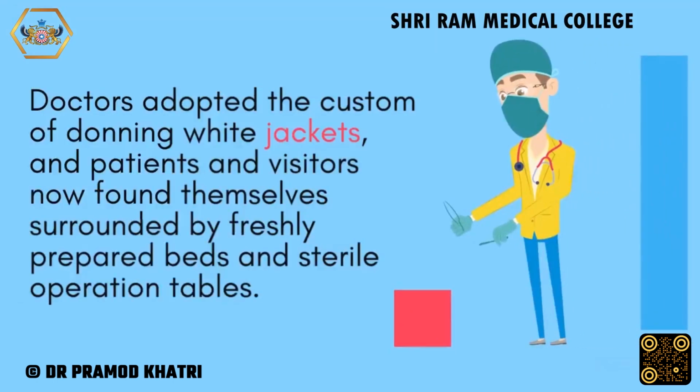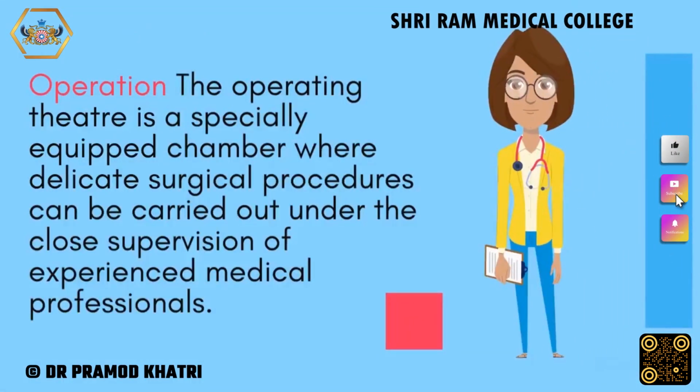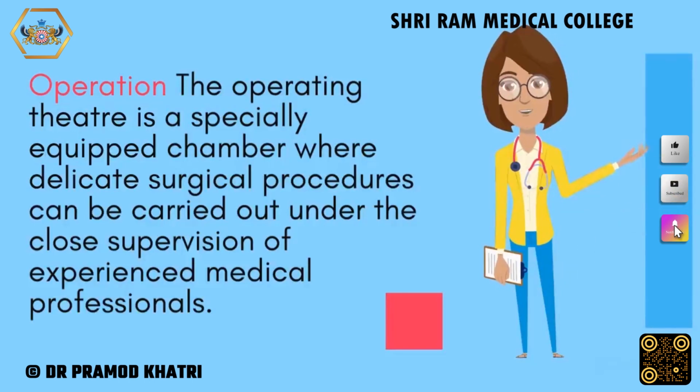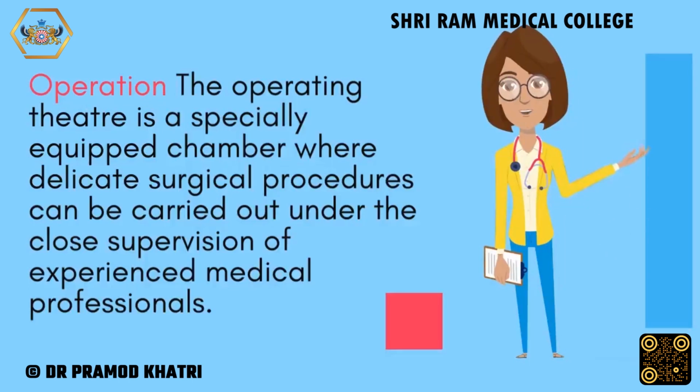Doctors adopted the custom of donning white jackets, and patients and visitors now found themselves surrounded by freshly prepared beds and sterile operation tables. The operating theater is a specially equipped chamber where delicate surgical procedures can be carried out under the close supervision of experienced medical professionals.